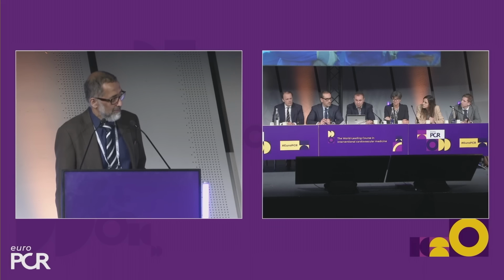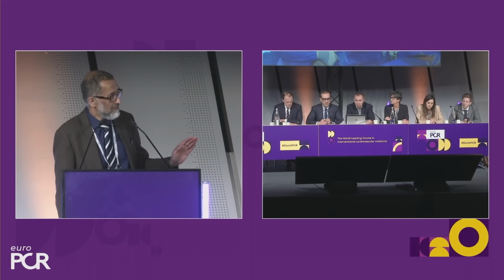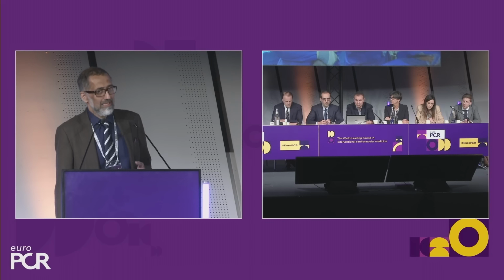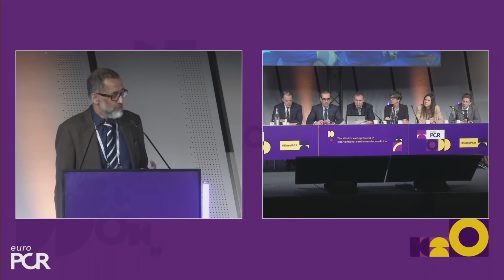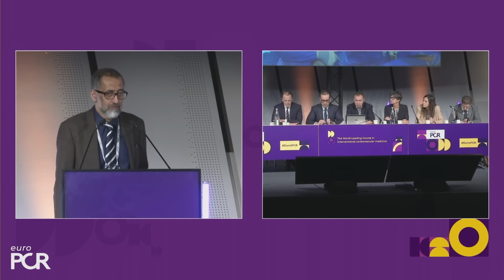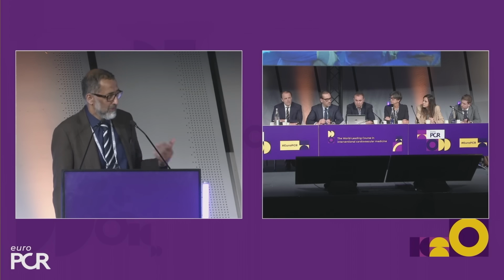Now, as soon as we did the BAV, she already had left bundle branch block. She was actually planned as a day case TAVI, so she's coming in the morning and the plan is to get her home in the evening. As we know, putting in a pacemaker loses some of the benefit that you gain from TAVI because the coordination of the ventricle starts disappearing. We don't know yet whether bundle branch pacing and things will be a solution to that.